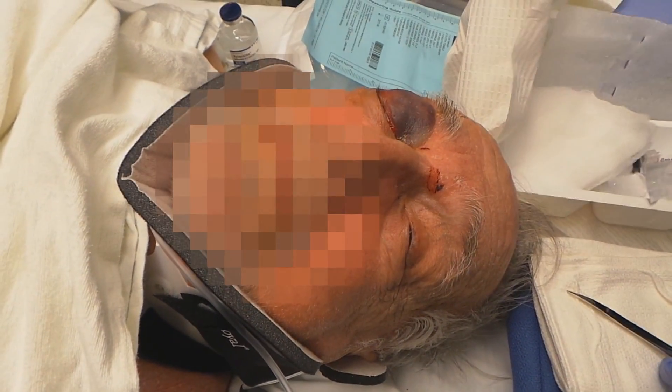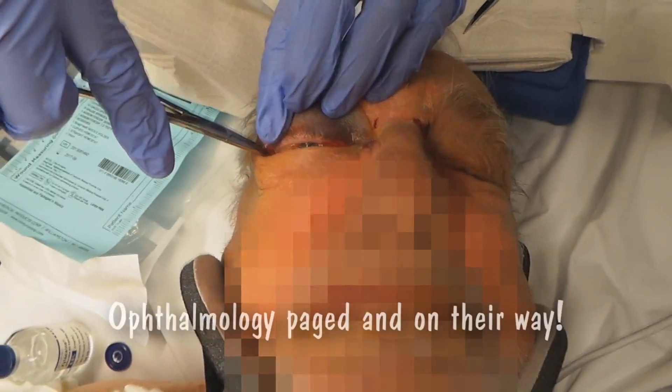So that's about one cc. I've got to do it while they're notified — has anybody called up them? I need to do this at the same time as notification.